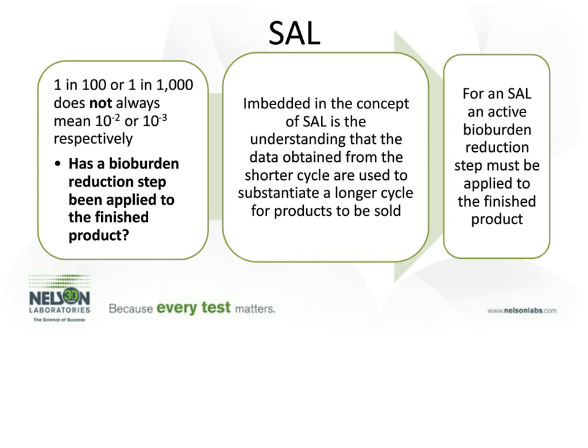And the question that we ask is, has a bioburden reduction step been applied to the finished product? That's a critical question to ask, because the whole concept of SAL includes an understanding that we are applying a shorter cycle and obtaining data at a shorter cycle, and then using those data to substantiate a longer cycle, which is used for terminal sterilization or complete sterilization of the products that are sold.